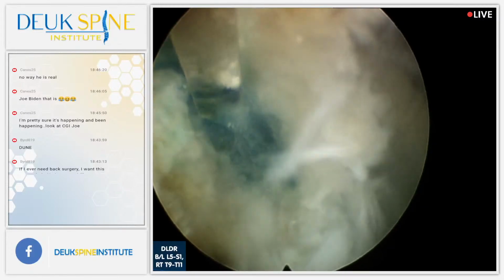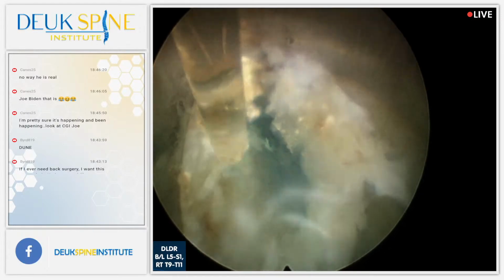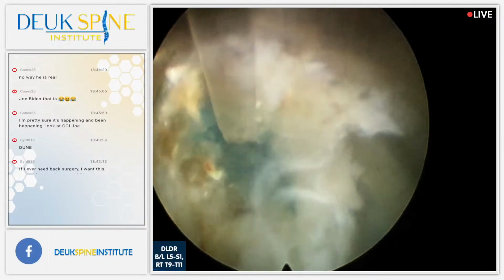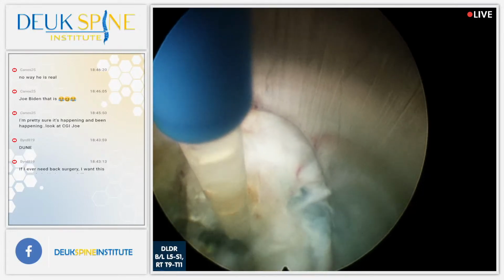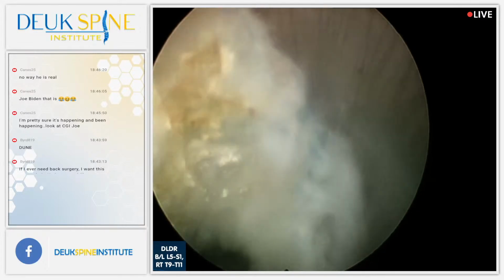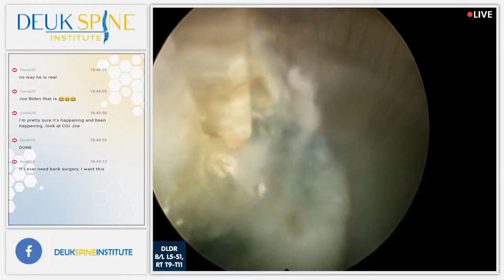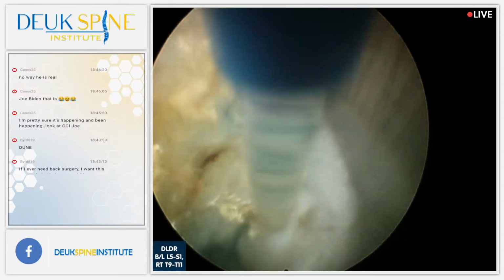You guys see the tear, by the way? The blue thing is the herniation inside the white tear. The white tear is the annulus fibrosus. It's the wall of the disc that's been ripped open, and the blue stuff is now coming out through it. We stain it with a blue dye because it makes it easier to see. This is all scar tissue. This whole mound right here is herniation and scar tissue. Look at the calcium, the gold color. Man, the scope is beautiful, Luis, by the way.